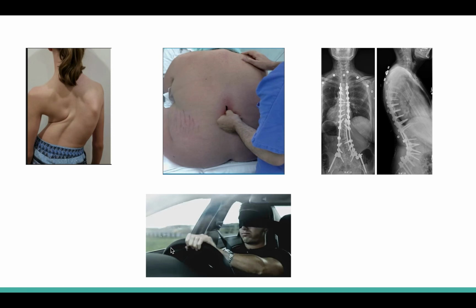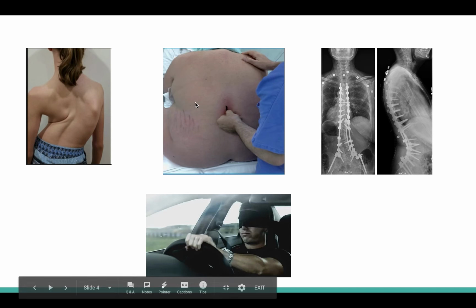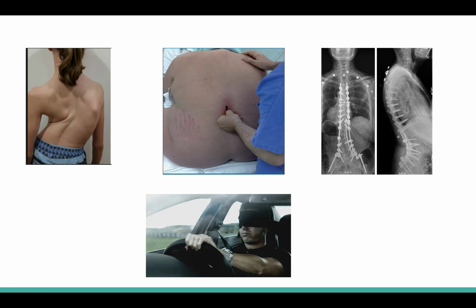And what's even more interesting is, when we struggle in this situation, we oftentimes repeat the same technique. When it comes to airway management, if we struggle, we switch to video laryngoscope or we go to fiber optic intubation. But with spinal epidural, we oftentimes just repeat the same sequence. We may try to redirect the needle. We ask ourselves where we are. We redirect the needle, and after a while, we may go to a different space. But we essentially repeat the same technique.